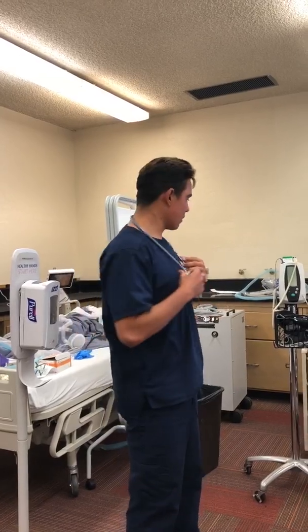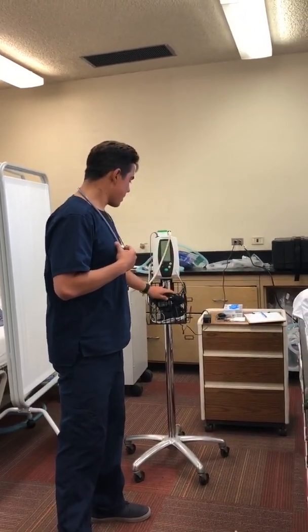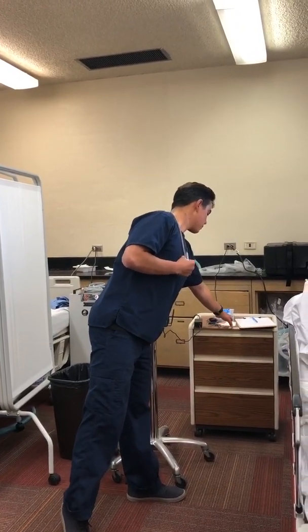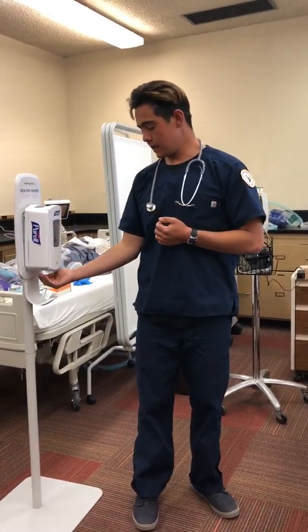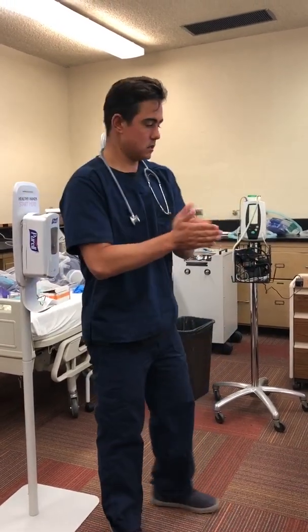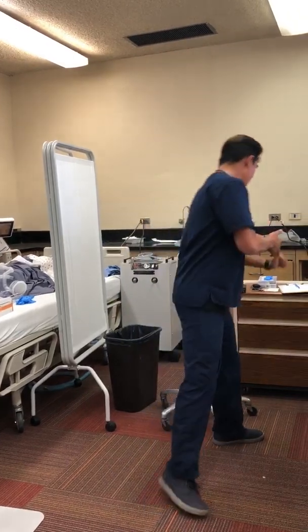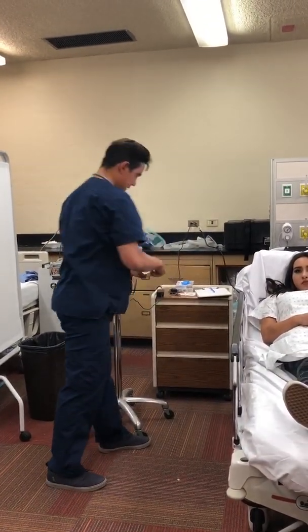For this I want my stethoscope, I have my vitals machine with blood pressure cuff, thermometer, I have my pulse oximeter, alcohol wipes for my stethoscope, gloves, and then something to record on as well. So I'm going to go ahead and sanitize. I'm going to enter the patient's room, and I'm going to enter while I'm sanitizing my stethoscope.